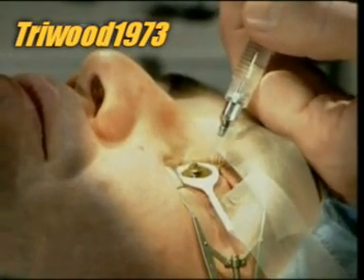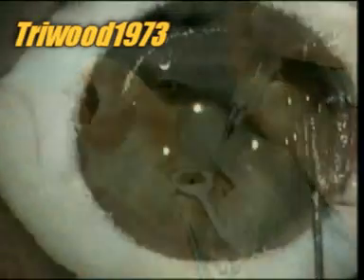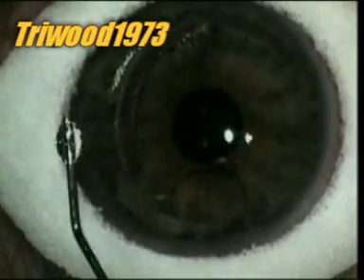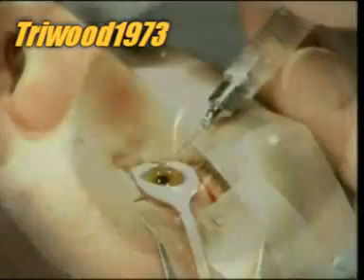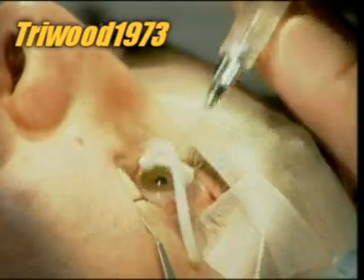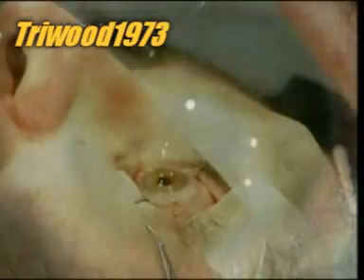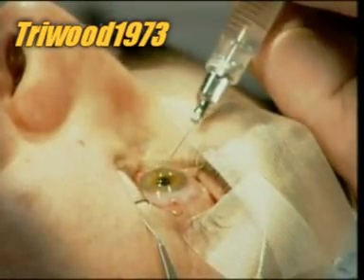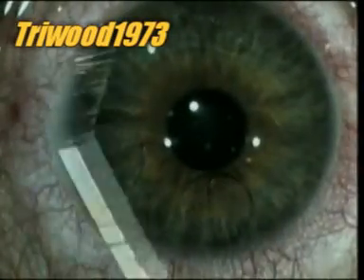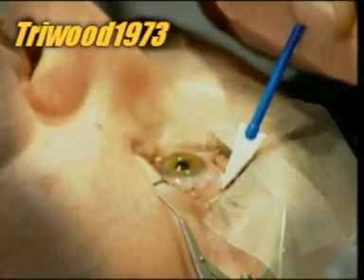The surgeon removes the sponge and then, using the ink marks he made earlier as a reference, folds the flap back to its original position. If the flap isn't precisely where it was before, the patient will have distorted vision. Using a syringe that flushes the area with sterile water, the surgeon carefully smooths the flap. Within 45 seconds, the negative pressure inside the cornea sucks the flap back on. The flap literally seals itself.